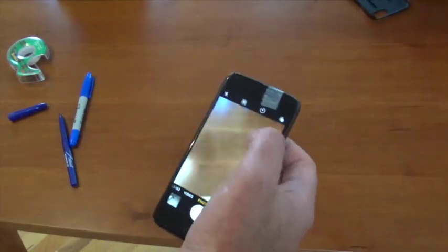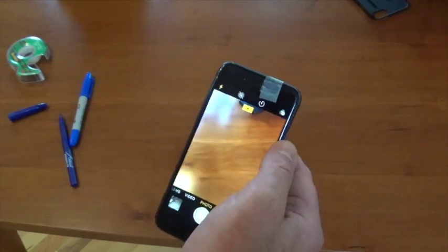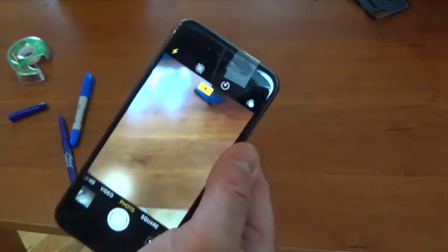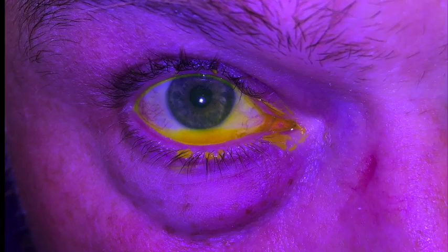If you need to take a photograph of the patient's eye, either for their own records or to show another provider, you can take your camera and put it into forced flash mode. Once you take a picture, you can zoom in and zoom out as needed, and you can really see a lot of detail. Here we see the fluorescein and the cornea, but also the patient's hideous liver spots, sagging eye bags, and glasses nose imprint.